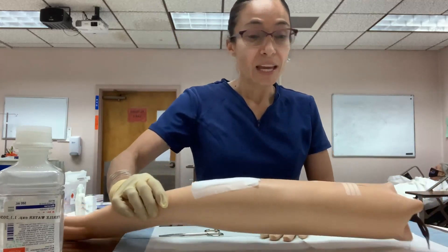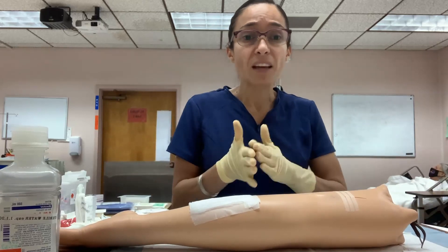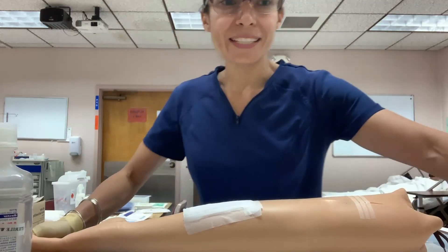Normally, staples and sutures can be removed seven to ten days after placement, depending on the doctor's orders. If the wound is not ready, you may need to call the doctor, who can extend the time up to two weeks. Always count the staples or sutures to verify that all were removed appropriately. Thank you.